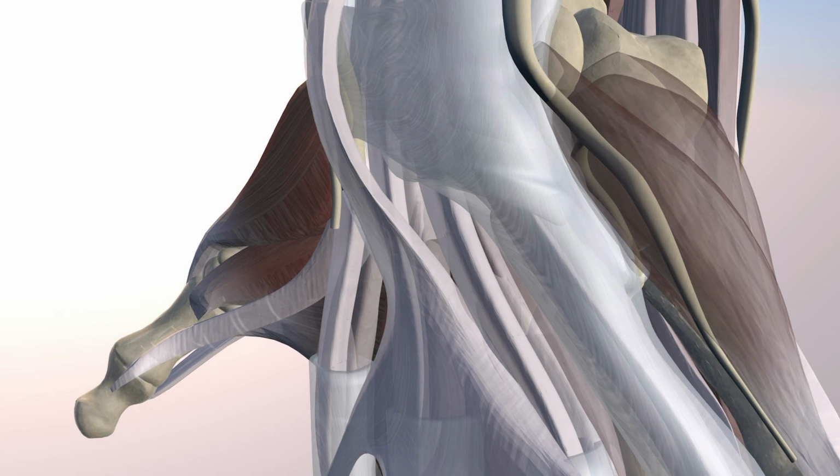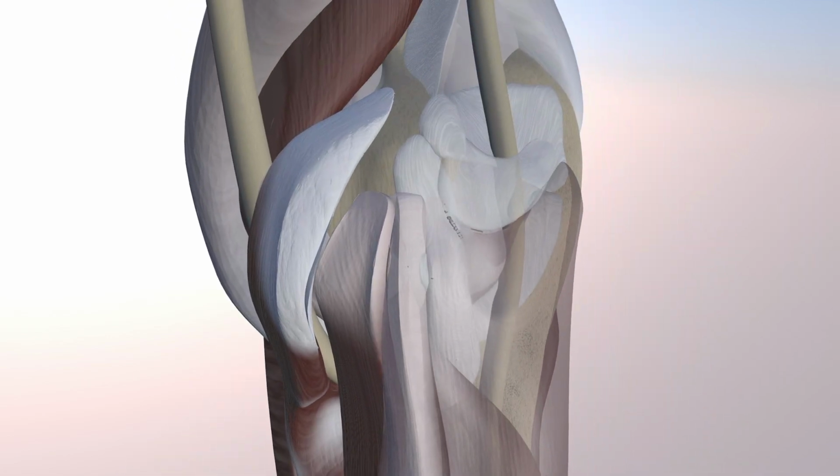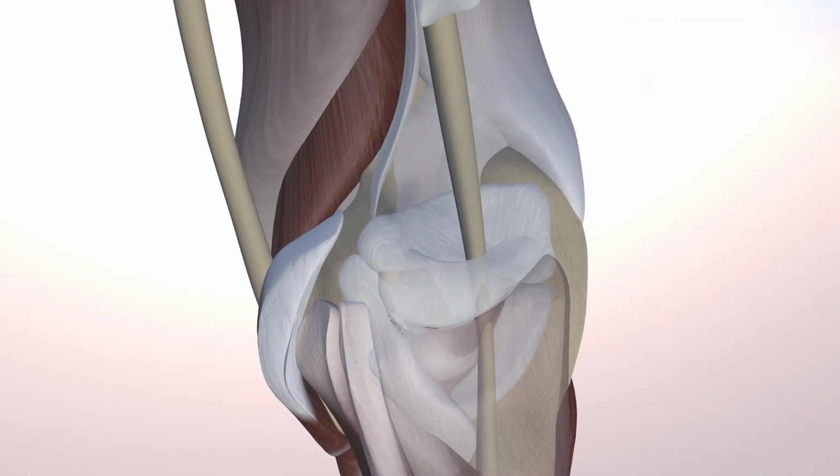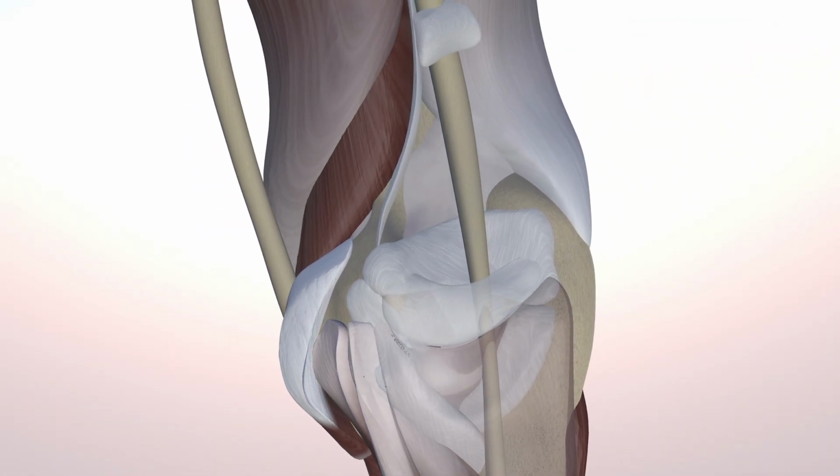Now we're going proximal again, and we're showing this patient that has an enlarged ulnar nerve, both proximal and underneath Osborn fascia. And then as you go distally under the arcuate ligament, it gets thinned out as it gets pinched in that region, consistent with the patient's cubital tunnel syndrome.